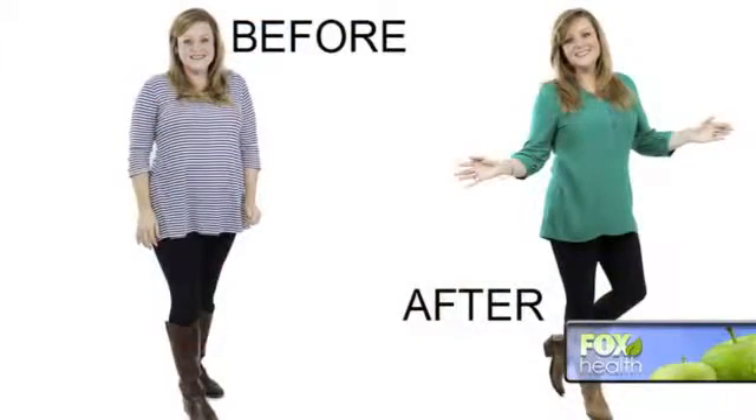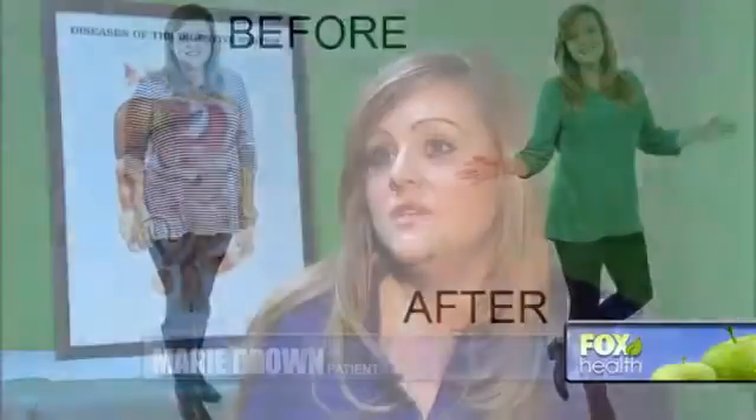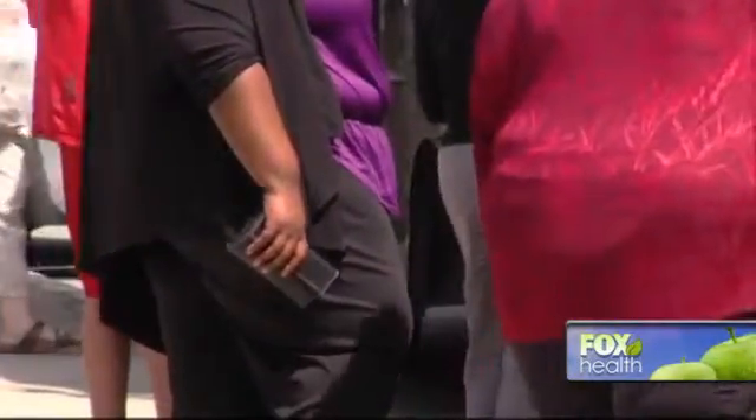Georgia native Marie Brown had the procedure done in December 2015. She says feeling full with the balloon has helped her lose over 20 pounds in three and a half months. It makes you feel full all the time, to the point that you're not angry about having to lose things like chocolate and cake and extra platefuls of food.